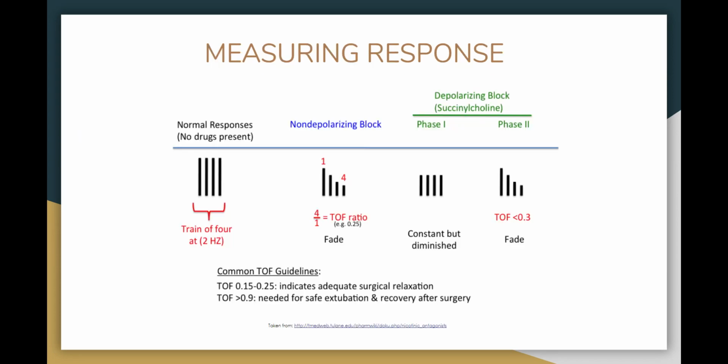The response of the associated muscle to the stimulus is measured in two ways: through the train of four count, which is a discrete quantity of twitches, for example 2 twitches, and using the train of four ratio, the ratio of the amplitude of the last twitch to that of the first, for example 80%. As we can see in the picture, a normal response to the electrical impulses is 4 twitches of the same magnitude. This would give a train of four count of 4 and a train of four ratio of 100%.